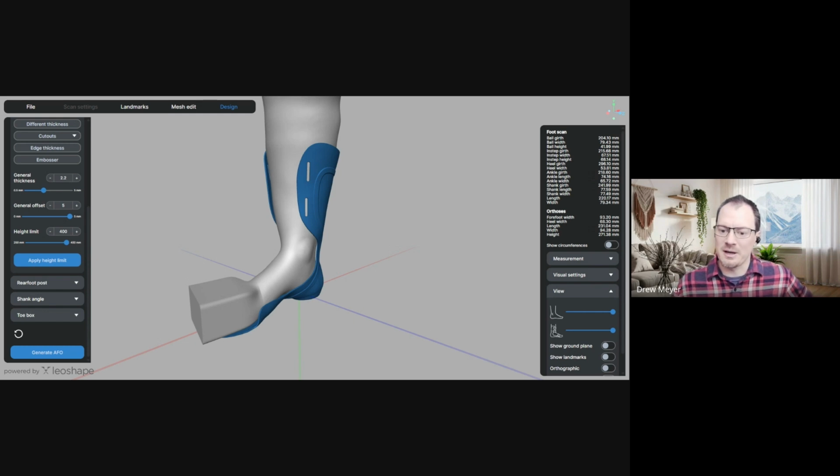You also said something positive. Our PP filament prints fuzzy skin. All right, that's great. Glad to hear. Keep up the good work, Sam.